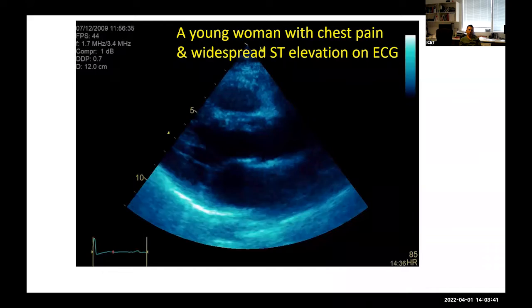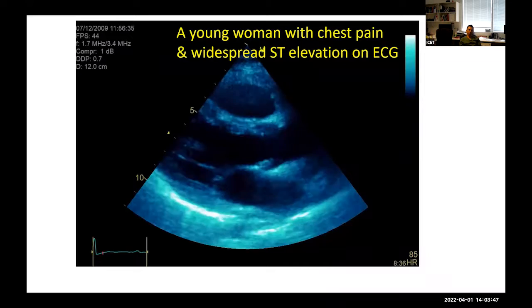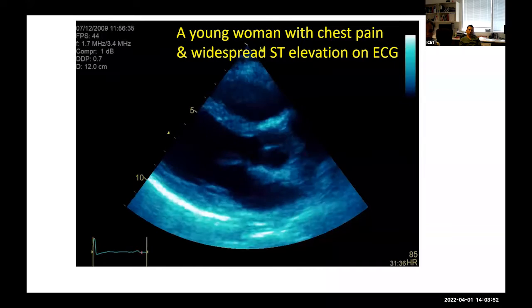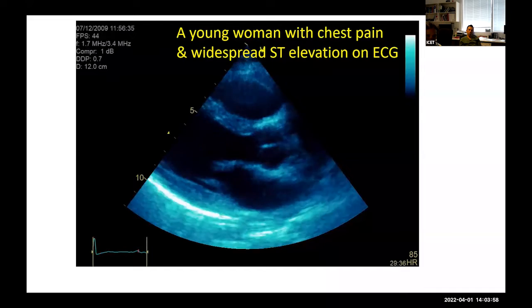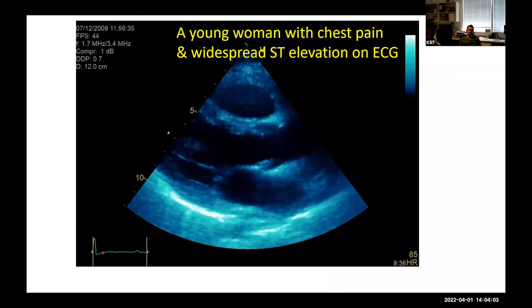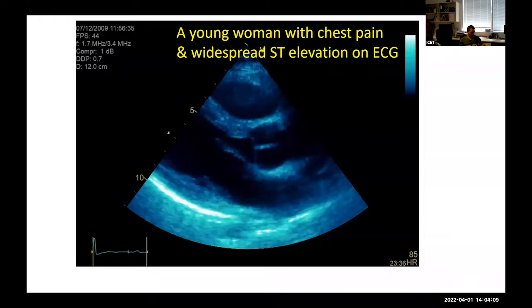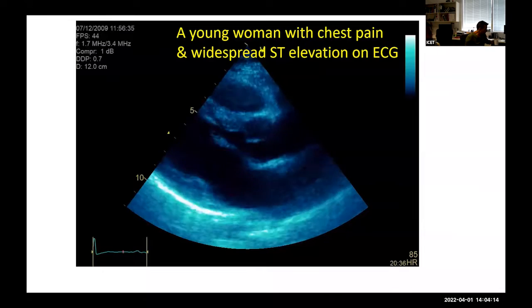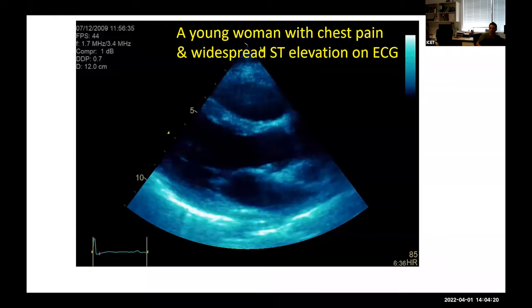So I'll be looking at the history. Regional wall motion abnormalities. No. On this picture, I can see that the RV and LV contraction is looking good. So this is the parasternal long axis view. You can see RVOT. We can see the aorta and left atrium, and there is actually a bright pericardial shadow, but it should not be more than 2 millimeters, I guess.